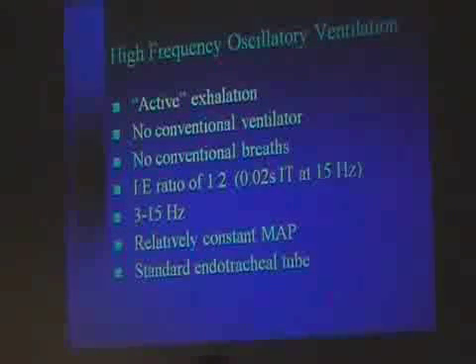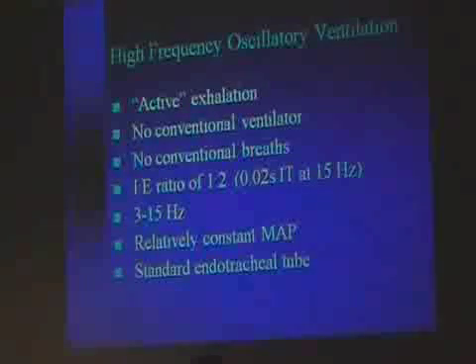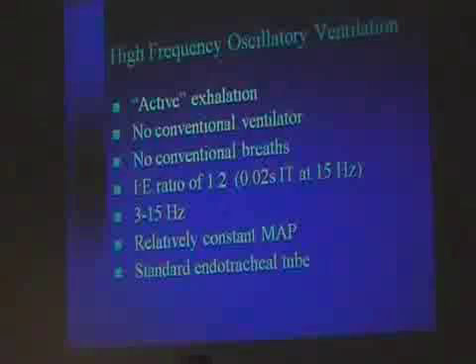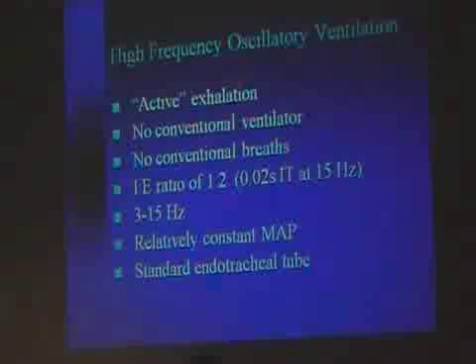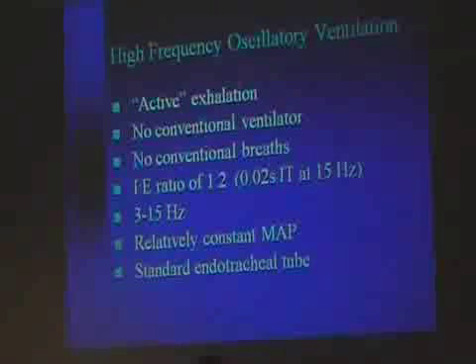Oscillatory ventilation, a true oscillator, is active exhalation. There's some sort of a piston, some sort of a drum inside that not only pushes air forward but pulls air back. There are a variety of ways that it can be done, but it is in fact active exhalation. No conventional ventilator is used with the oscillator that we have today. Now, this is going to change.